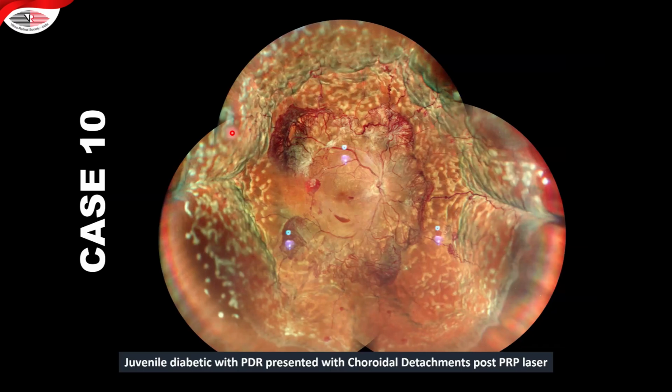A case of a juvenile diabetic retinopathy, a patient had come to us treated elsewhere, recently lasered. You can see the whole laser, which is laser marks 360-degree, florid neovascularization for which the laser was done. And the patient has developed 360 choroidal detachments. This is one of the side effects of extensive laser that can cause choroidal detachments, effusions, and lead to visual loss.